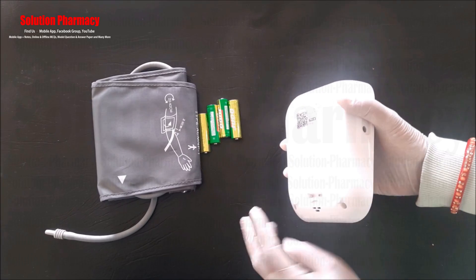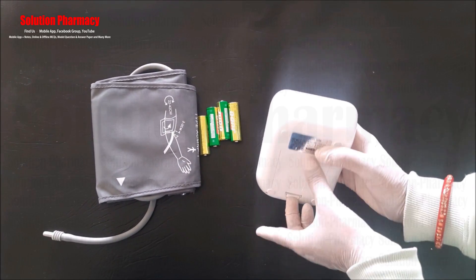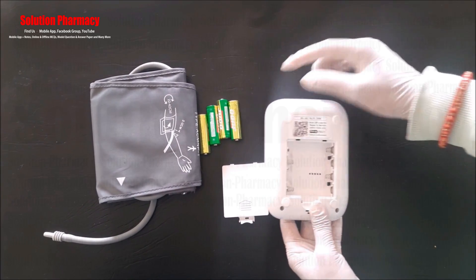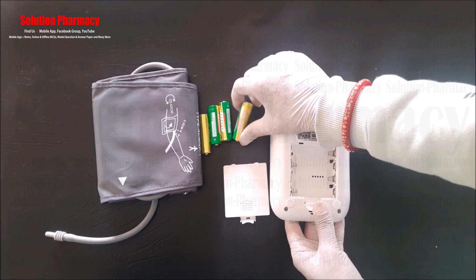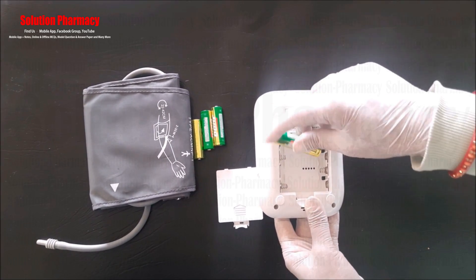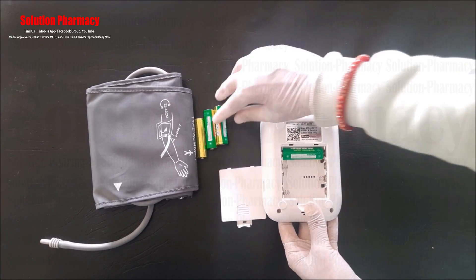This is the USB socket where we connect the USB cable provided with the Medtech BP monitor kit. The battery compartment is located at the back side of the device. Open the cover and attach the batteries — you can see the four batteries provided in the kit.